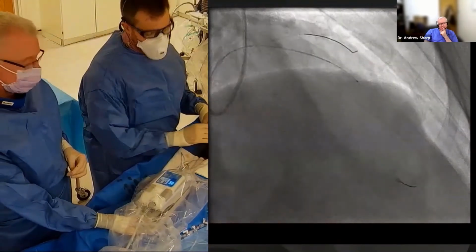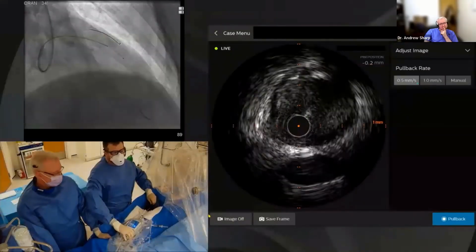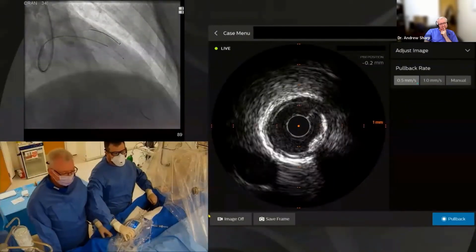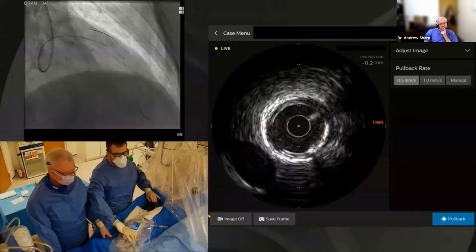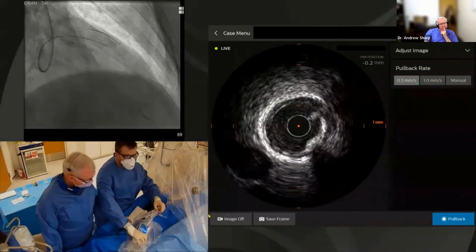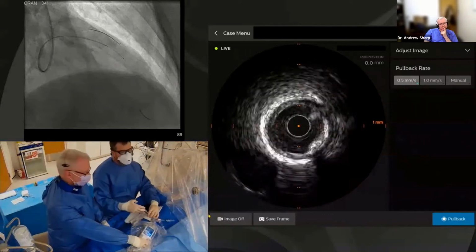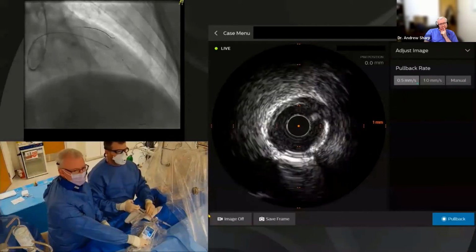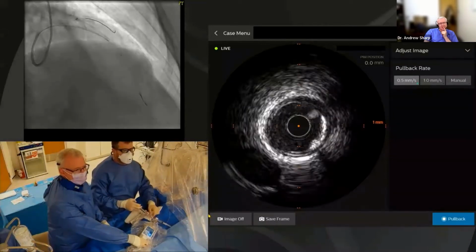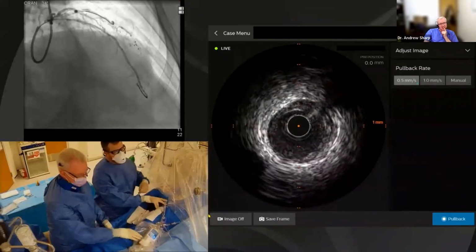About there is where we're looking. Okay, so our image is on. We're pretty distal there. Not sure we're quite as distal as you think. And we threw that ectatic segment. What is it? I call it ectatic. It's actually the normal vessel. That's where we are. On we go. Okay, great.